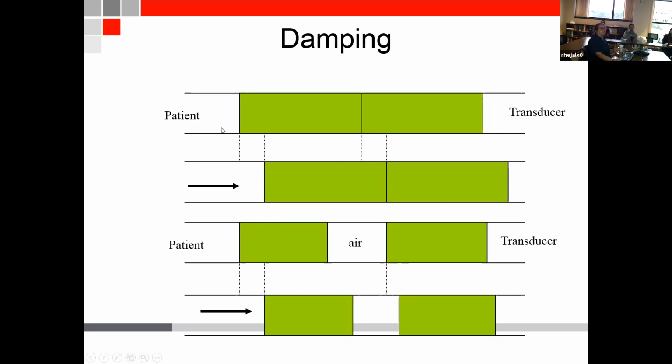This is just a reminder of what dampening is. This is the concept that you have on your car brakes. When you push on your brake, there's a continuous fluid that gets from your little foot to the big wheels. So the pressure that you get multiplied by the little area is equal to the pressure that gets there multiplied by the area of the wheel, and you end up with stopping the car. Same thing here.